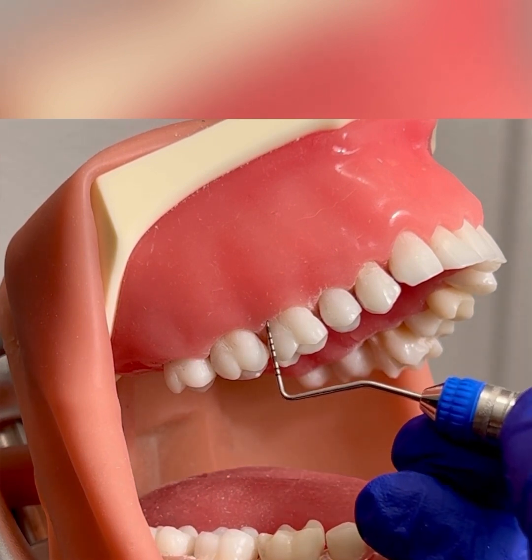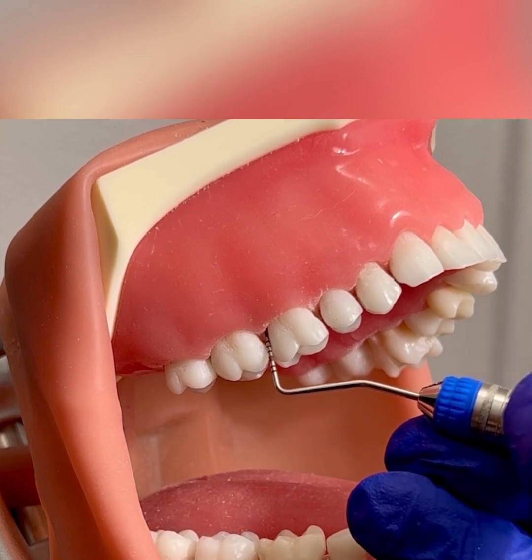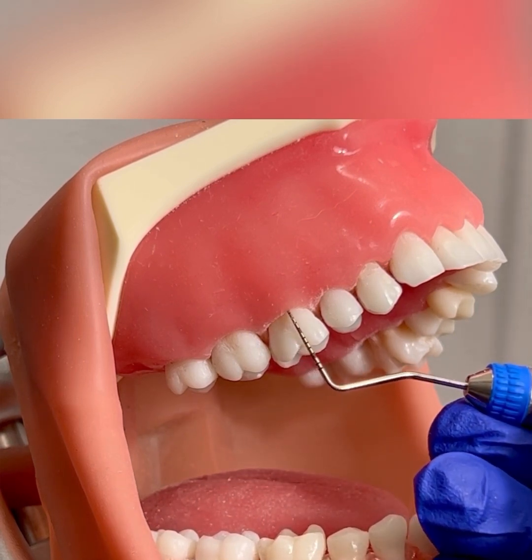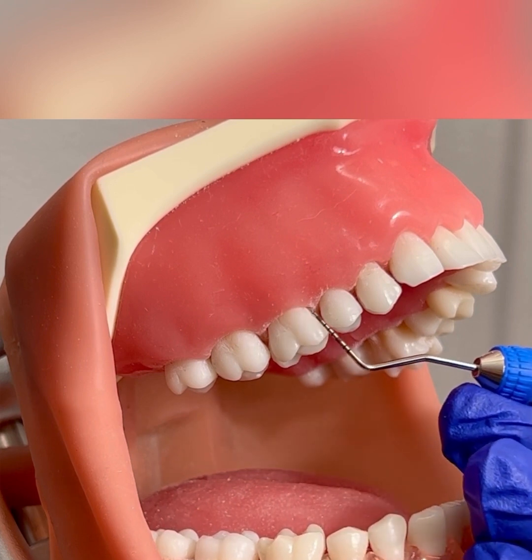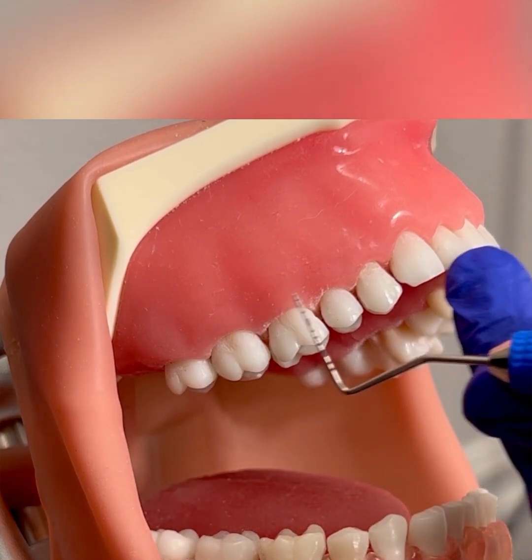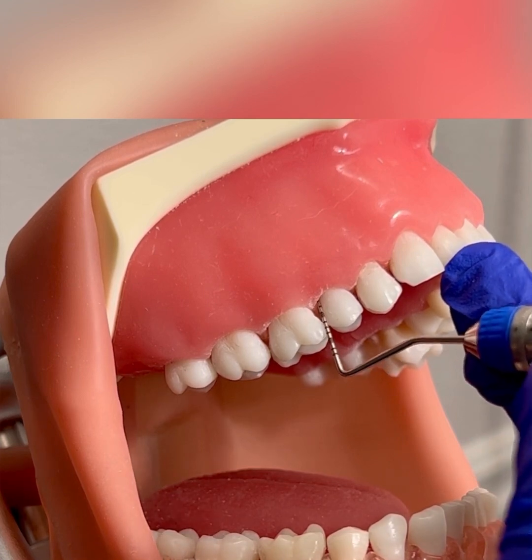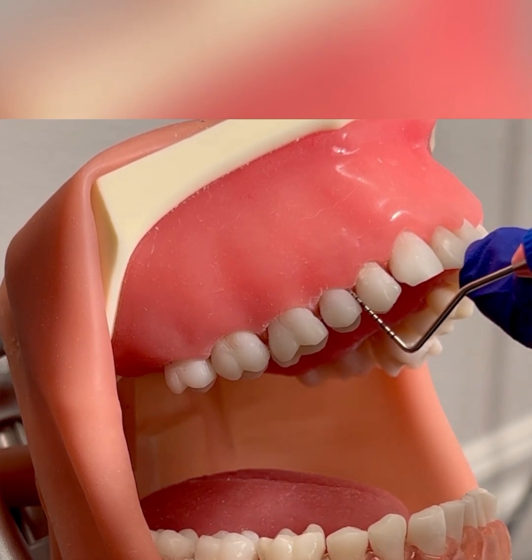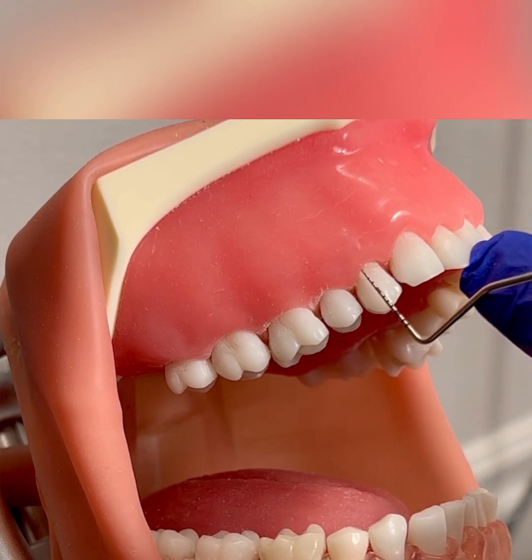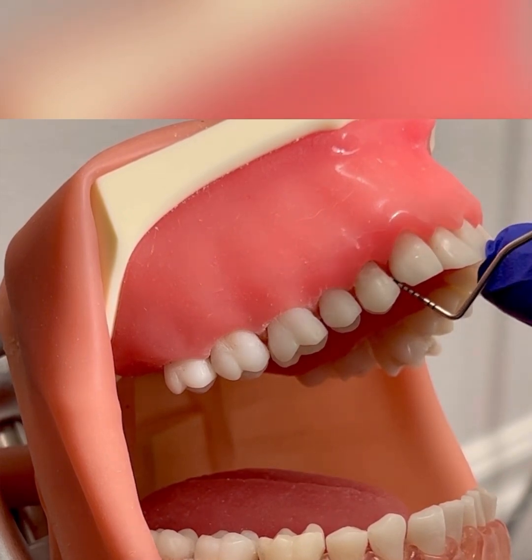Tooth number three: insert at the distal buccal line angle, walking the probe into that distal and proximal, angling into that col. I'm using a one millimeter walking step across the buccal, again into the mesial. You can stay extra oral with your fulcrum or you can go intraoral on an incisal tooth surface. Continue across tooth number four, inputting your readings in Dentrix, across the buccal with one millimeter walking steps, into the mesial, keeping in contact and tilting into the col.